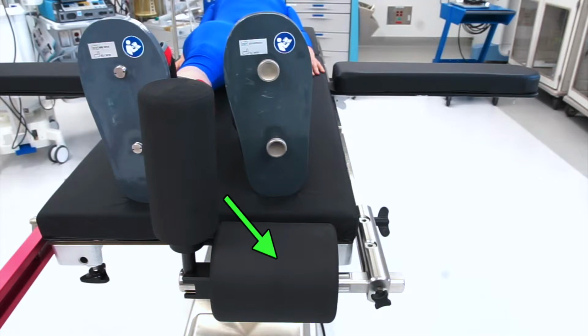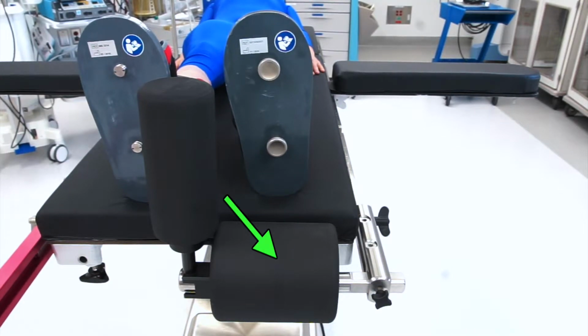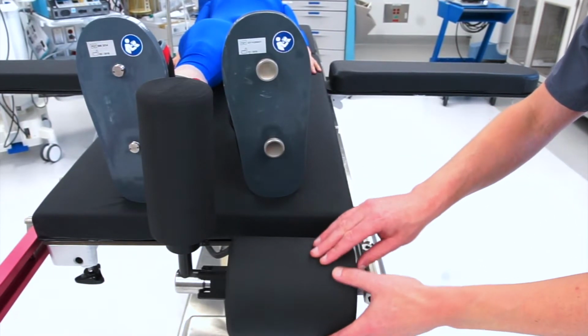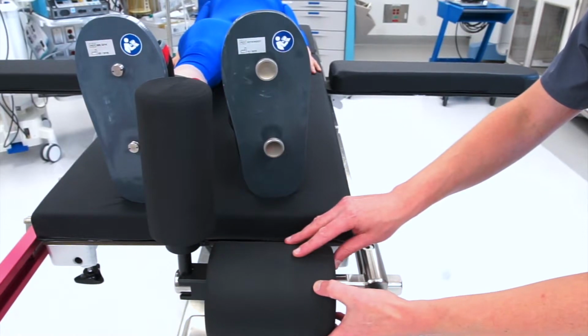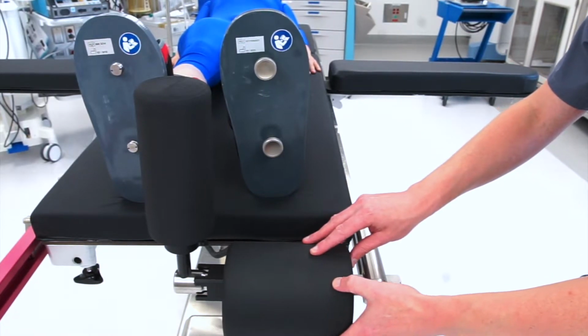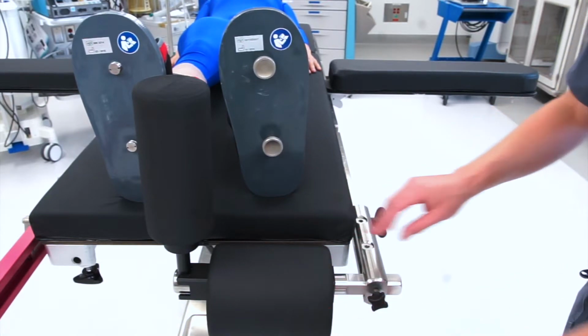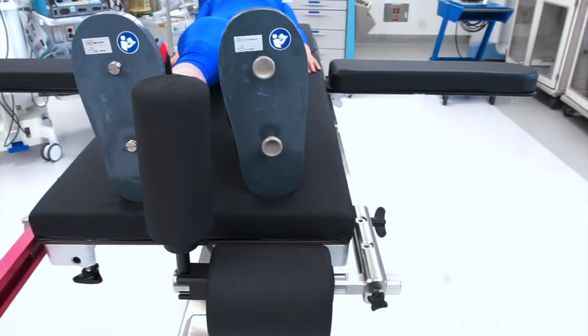The femoral support acts as a fulcrum to lift the proximal end of the femur during leg extension. To adjust support height, slide it laterally, rotate the support, then slide it back medially to lock it in place. There are 3 height settings available. Height setting is based on surgeon preference. The femoral support can also be removed if needed.